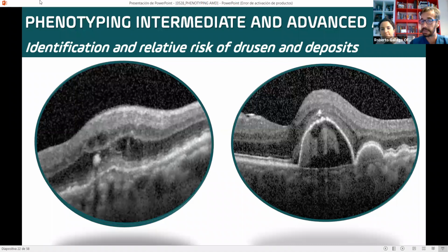And you were talking about confluent soft drusen, drusenoid PEDs. I can see a little bit of subretinal fluid there. Is there an indication for treatment in such cases? Normally not. It's more like a positional status of the retina that cannot fold and follow this elevation. Mm-hmm. But I will carefully also follow this patient to see if there are changes maybe in 1 week or 2. Okay. And also OCTA nowadays is really useful. I don't like OCTA. Okay, I like it. Okay.